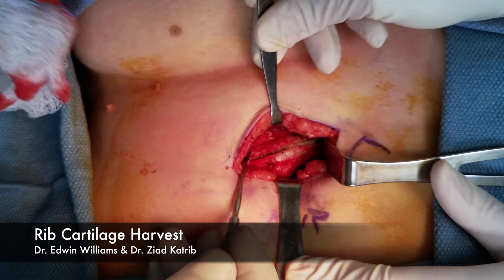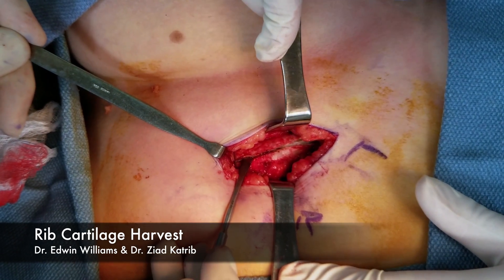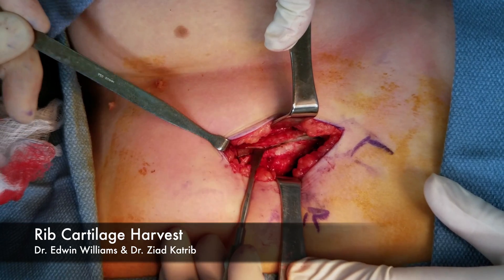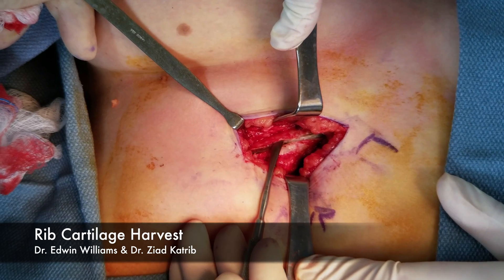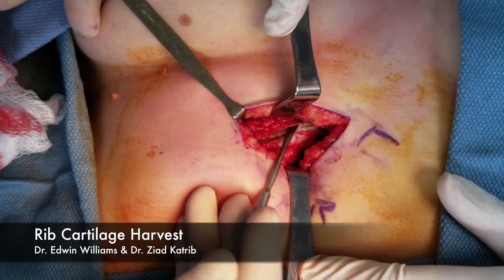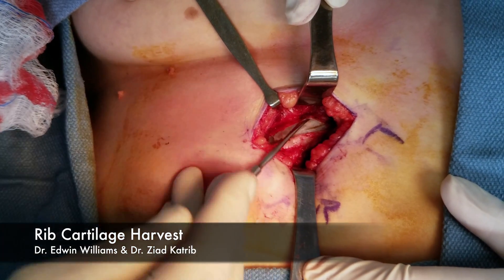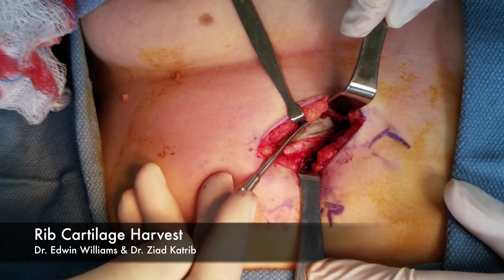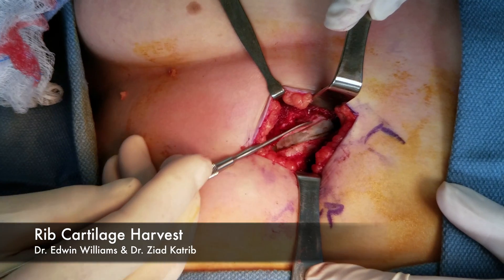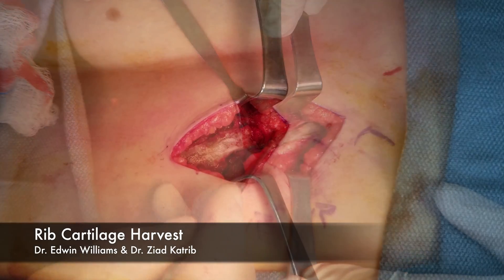We're going to continue this dissection. We're just taking a strip of this periosteum. Try not to injure any of the underlying rib, for obvious reasons — we're harvesting it so we don't want to cut into it at all. It just takes a little bit of time. Before we started doing this, I found the patients were a little more uncomfortable. It also gives you one more layer between you and the pleura as you're doing your dissection. We're getting over the top end of it now, taking it laterally.